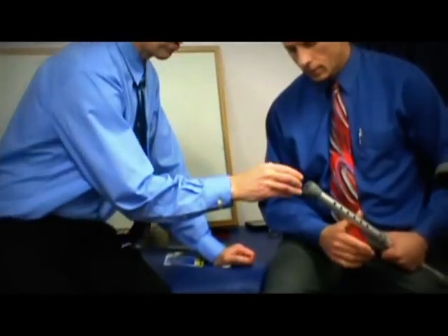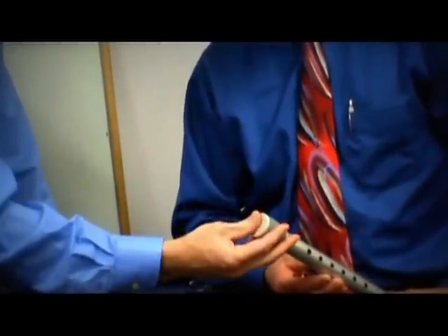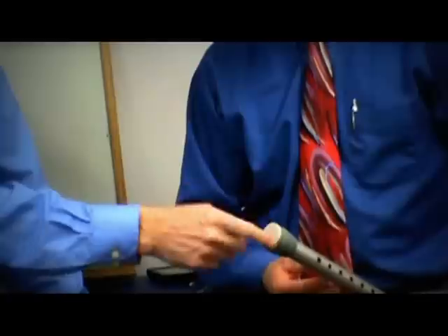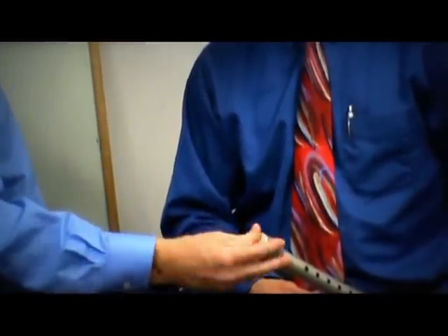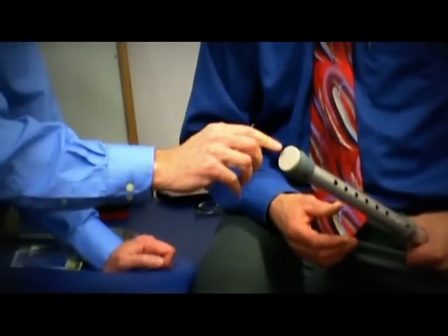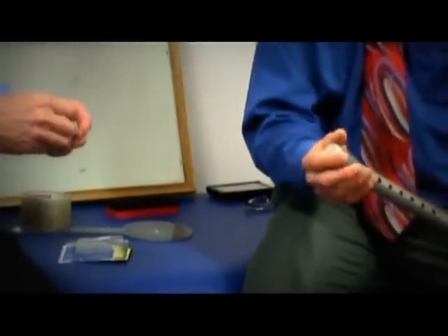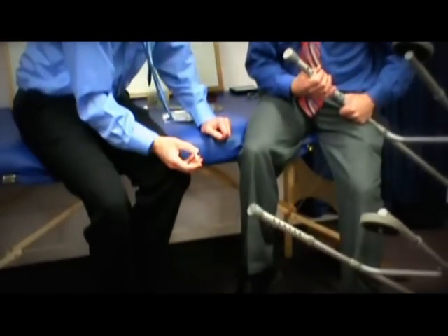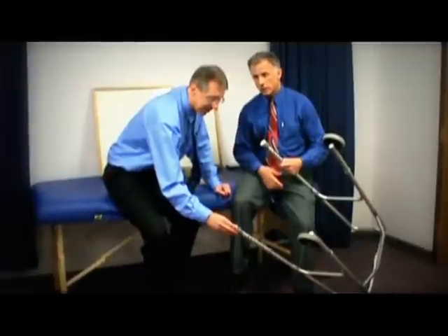First off, these are very inexpensive. They have their own self-adhesive on there, so you just take it off and put it on the back like this. It fits just about perfect. What you do need to do is tape it in place, because these could flip off. The adhesive isn't quite enough. I would probably use the universal duct tape. I use electrical tape myself, because it stretches and you can really tighten it up on there. And you can get it in different colors too, like duct tape.